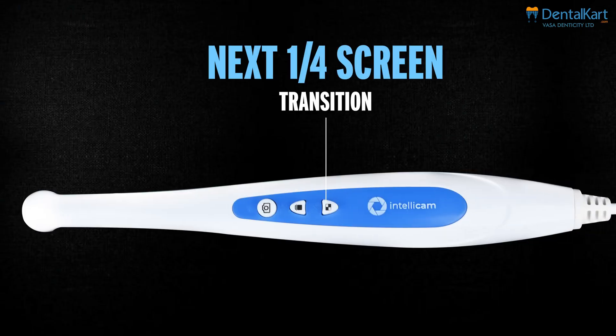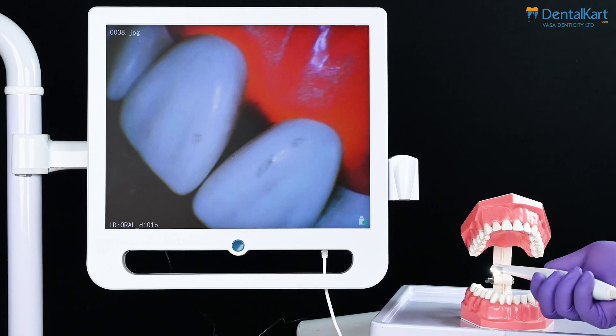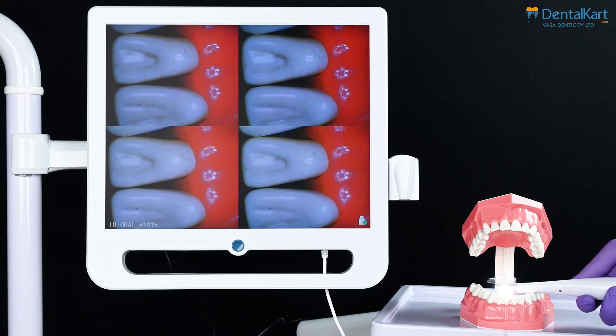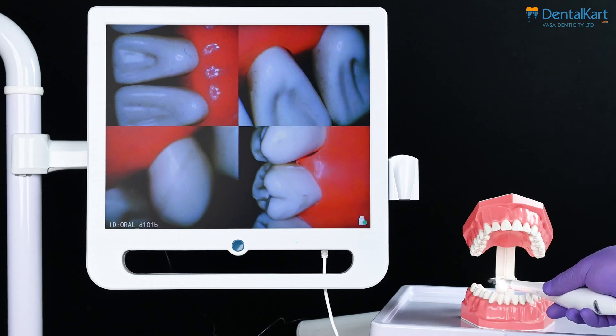Next is the screen transition button. When we press this button, the monitor image can be switched between single image mode and four image mode in viewing mode. In four image mode, it's essential to click four images — the mode settings won't be stored if less than four images are selected during the session.